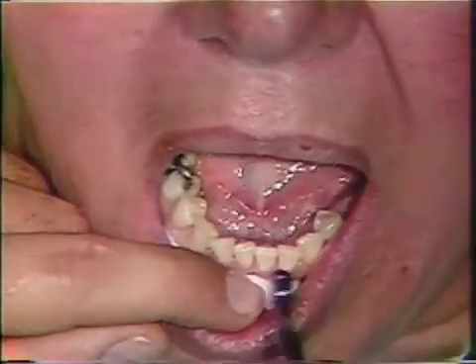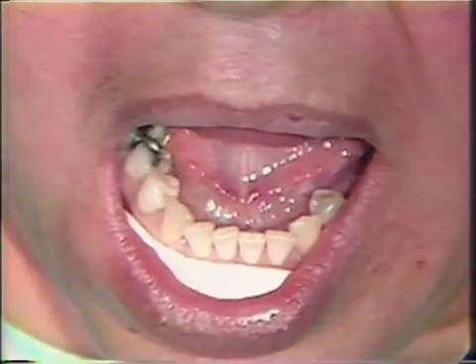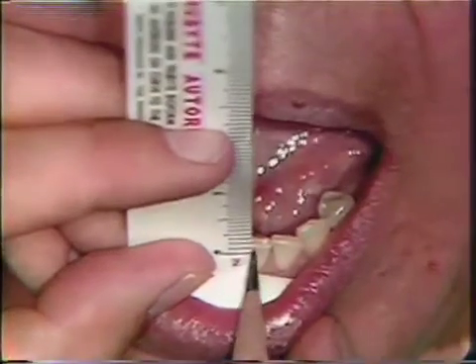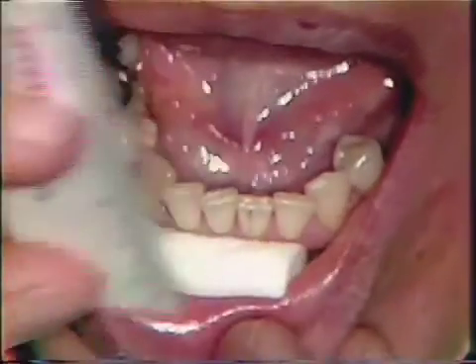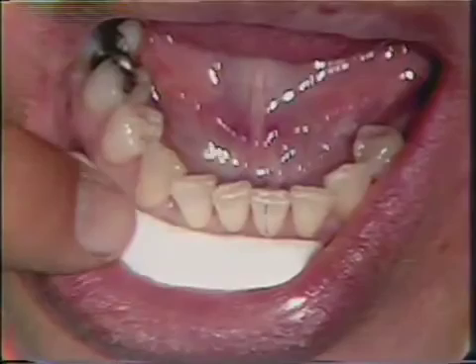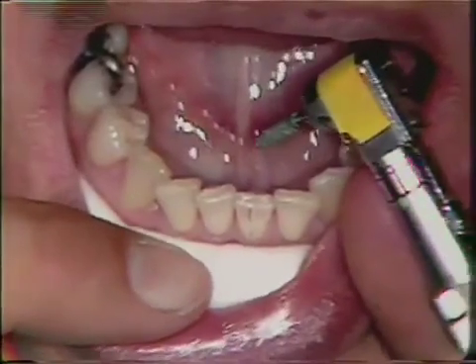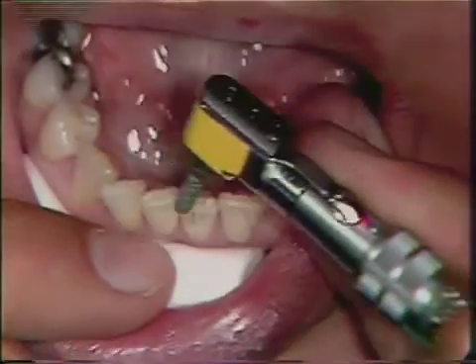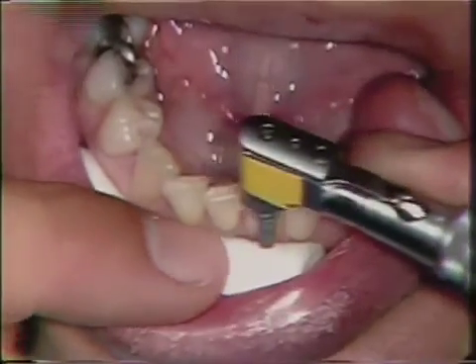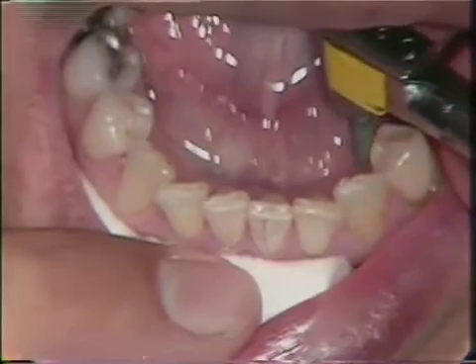Now this is going to be subject to error. We have to do this visually, and there's no real good double check. I'll take a straight edge; I have an idea of that exact path of insertion, and I'm going to scribe that line on the patient's tooth. With the slow speed handpiece and a parallel-shaped, barrel-shaped stone, I'm going to line it up with the anterior and then disk the lingual surface. Just take that back and disk the lingual surface of the bicuspid.